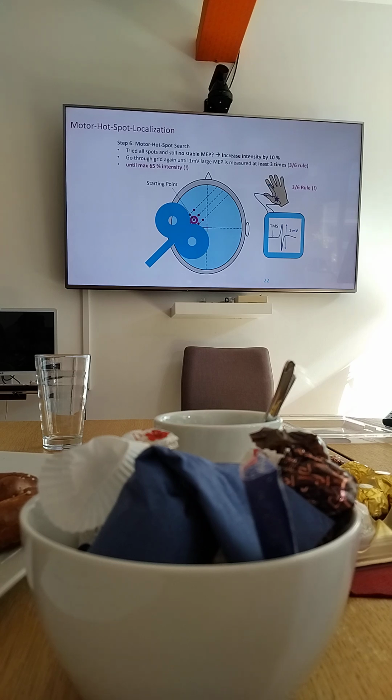I would say, Katharina, please correct me. Here, the European Caucasian heads have on average something like 40-45 of the maximum output as a motor threshold. No, in between 40 to 60. Okay, 40 to 60. And now, wait till you write it down, because now comes the funny thing.